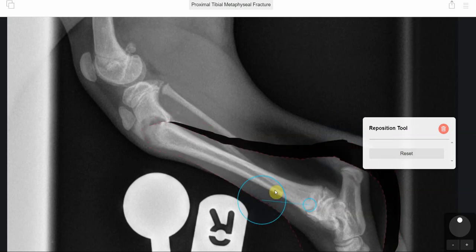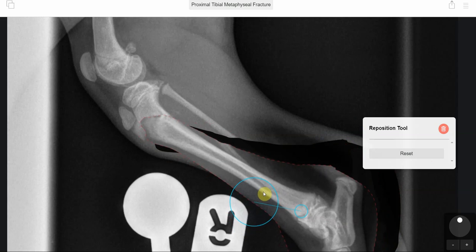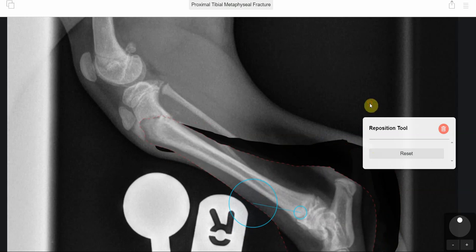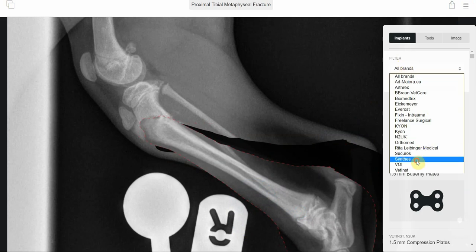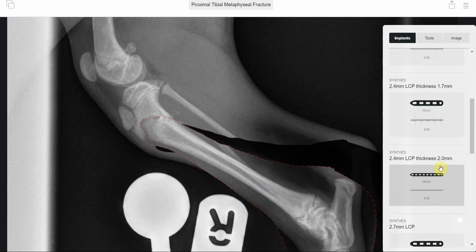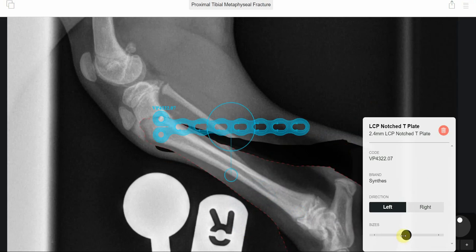We managed to reposition it using software called VPOPPRO, and we managed to visualise what the implant would be that would be best suited to this. The one that we thought would work well was one called a Mickey Mouse plate, or a LCP Notch T plate.